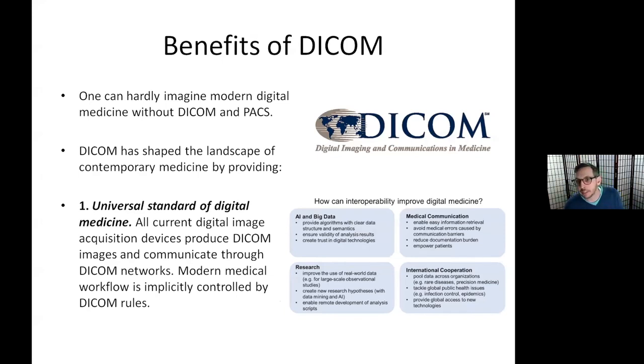So what are the benefits of DICOM? I'm running low on time again, so I'm getting close to that. The benefit of DICOM is that it's a universal standard. It's a language that allows interoperability, allows things to work the same in Japan as in Nigeria, as in Florida, as in California, as in anywhere. As long as we adhere to it and are clear about what elements we are adhering to, it allows us to communicate all around the world.